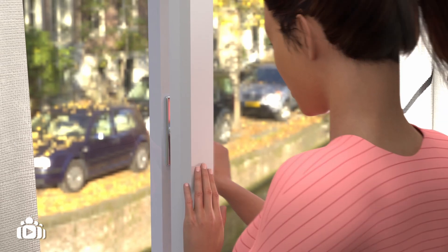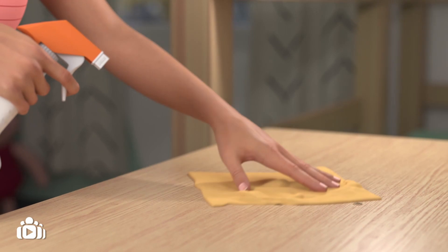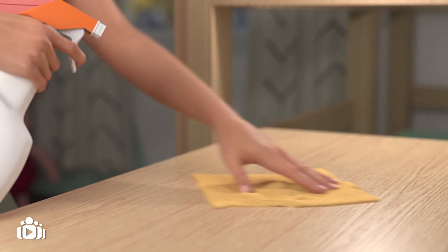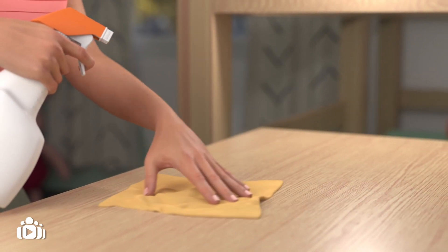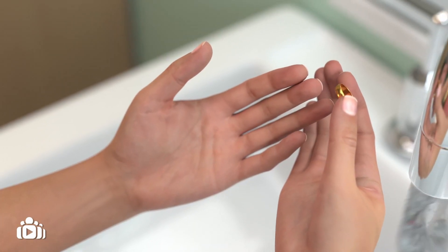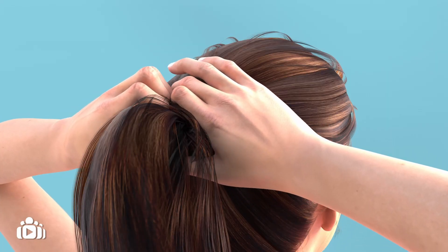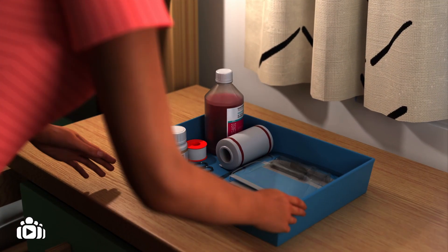First, close the windows and turn off the air conditioning. Prepare the room and yourself. Spray any surfaces and or desk space in use. Wash your hands after removing jewellery from your hands and wrists. Tie your hair back or wear a hat. And prepare the medical set provided to you.